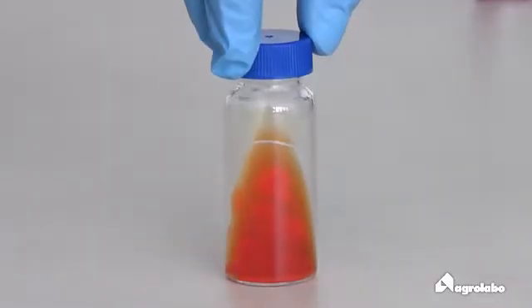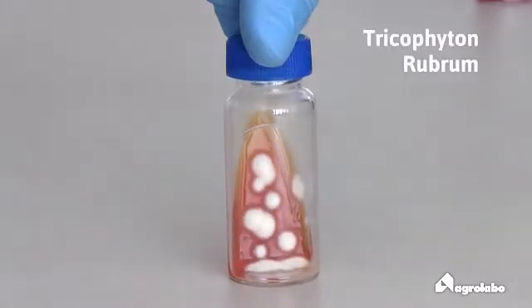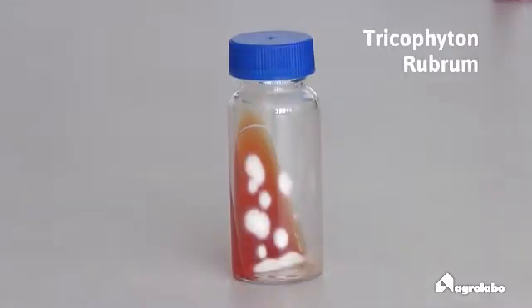The colony is flat or with flowery and cottony velvety heaps. The color is white cream, then dark rose. Reverse side: purple-red.